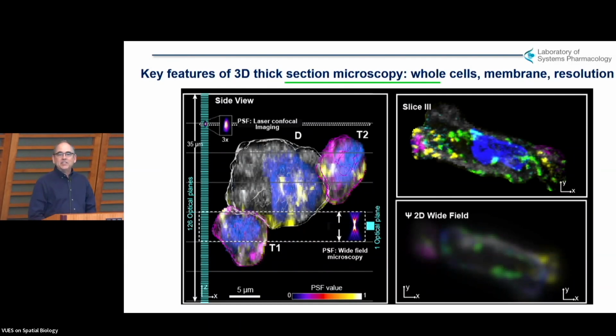So from a visualization standpoint, the challenge here is we're looking at problems where there might be 10 to the 9th cells, so a centimeter or 2, and yet we're trying to go down to features that are subcellular, so around 4 logs in terms of dimensionality. And you can imagine that data set is going to have to be dynamically loaded and visualized.